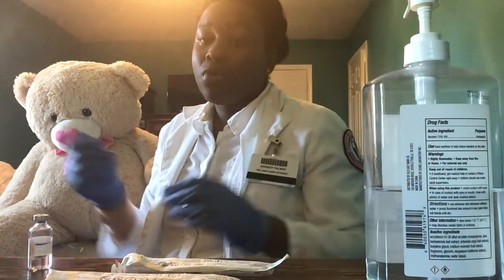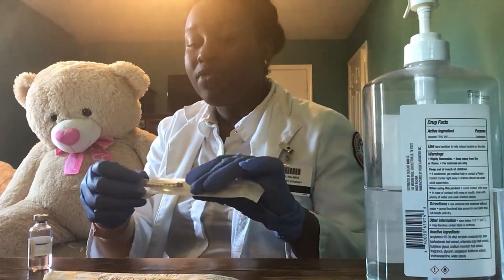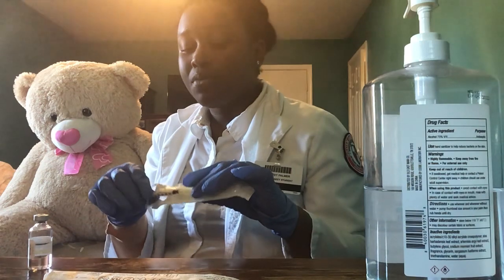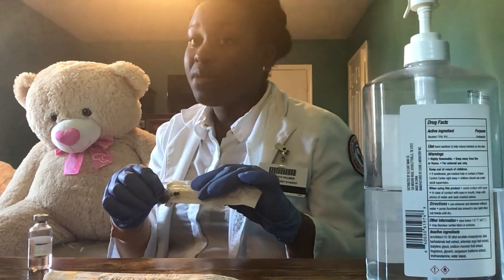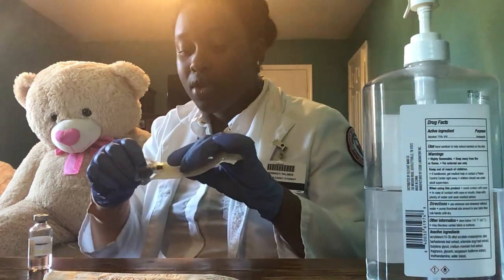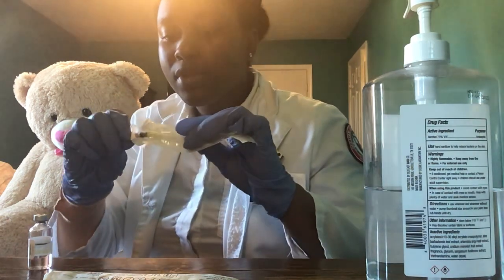So the order was to give 4 milligrams of Haldol. However, on hand is 1 milliliter per 5 milligrams. Therefore, I will be injecting 0.8 milliliters of Haldol into the patient. So I've opened my syringe. I'm going to remove the cap off of it.